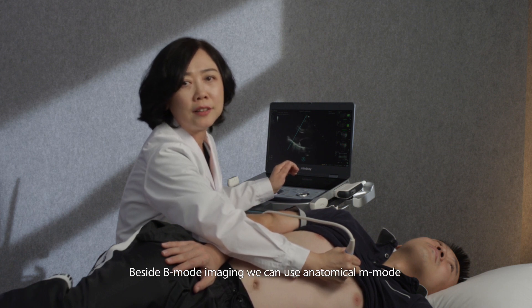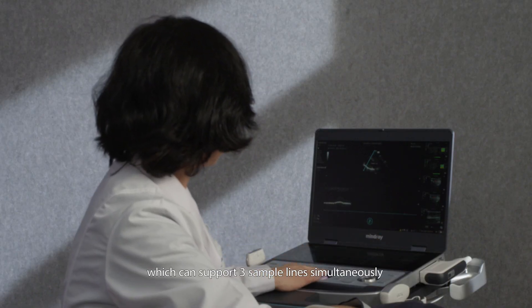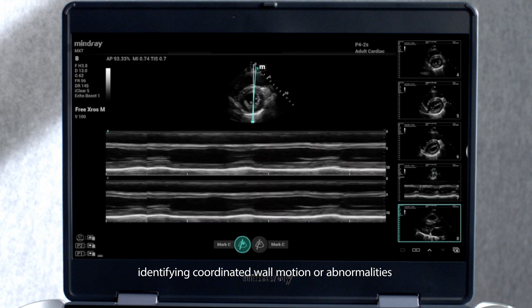Beside B-mode imaging, we can use anatomical M-mode, which can support three sample lines simultaneously, identifying coordinated wall motion or abnormalities.